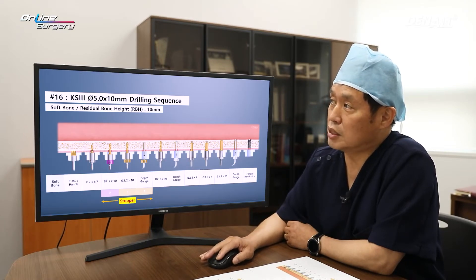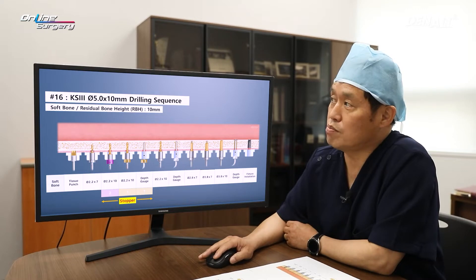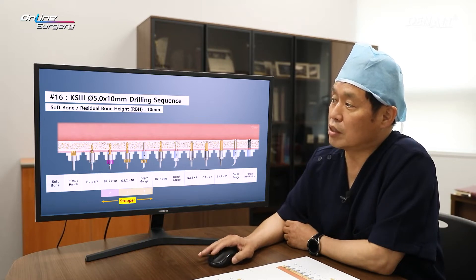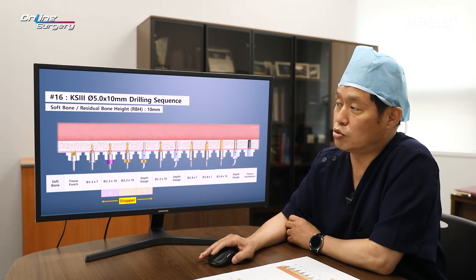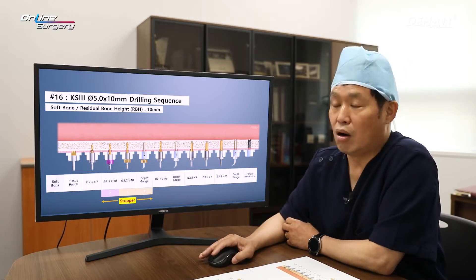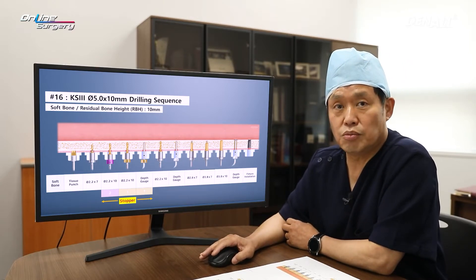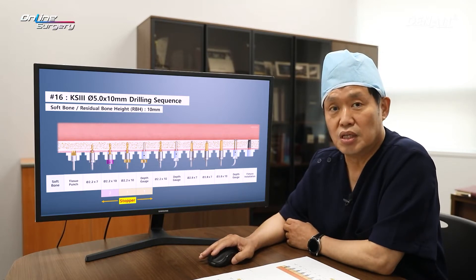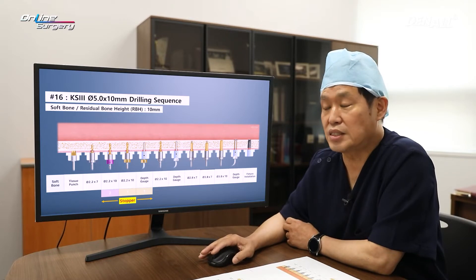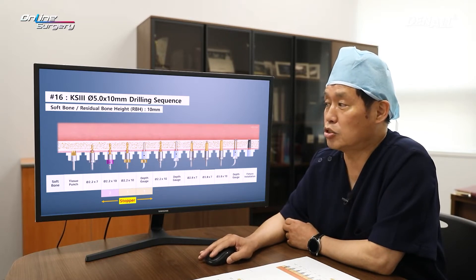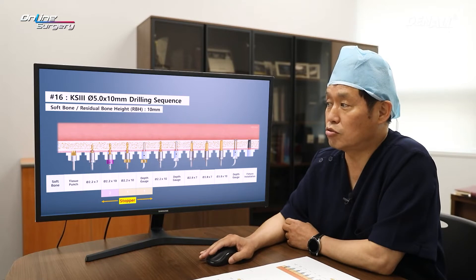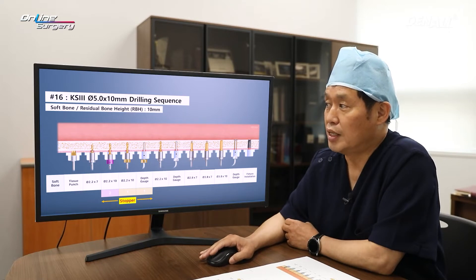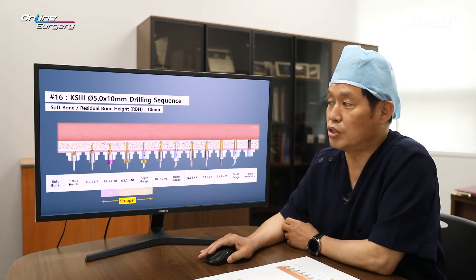In number 16, a 5.0 by 10 mm implant was planned. The drill sequence was as shown. This was one cast drill. If you have used one guide, you know. But in the case of one cast, unlike the cast drill which is for freehand, you need to use a stopper, so this can be confusing. Therefore, I'm going to provide explanation on this point.